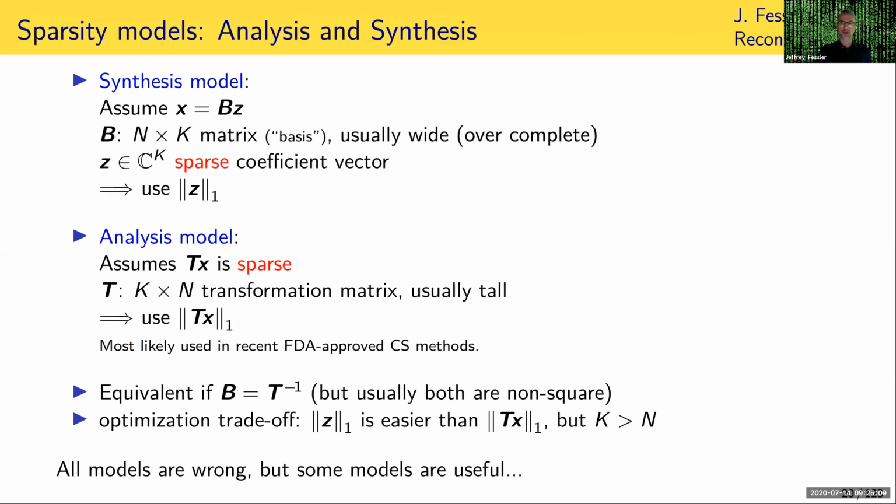At the time I first made these slides, I said this was most likely used in the recent FDA-approved compressed sensing methods. I've since had conversations with people in the companies, and I know a little bit more about what's under the hood, and this is indeed the kind of regularizer that's being used as we speak in the compressed sensing methods, at least in some of the companies' compressed sensing products.